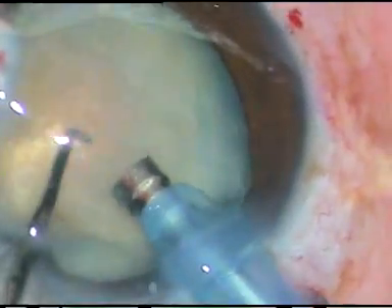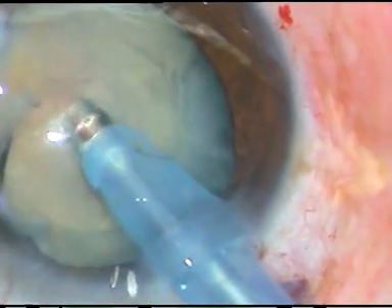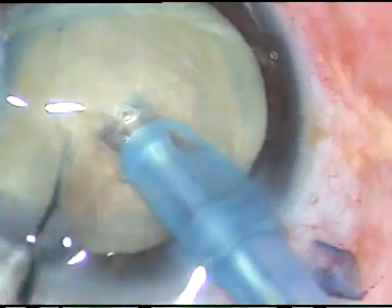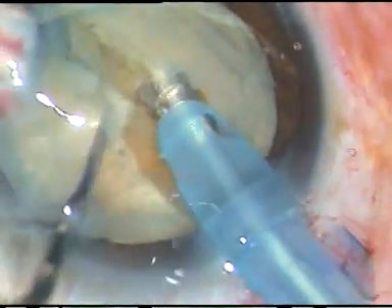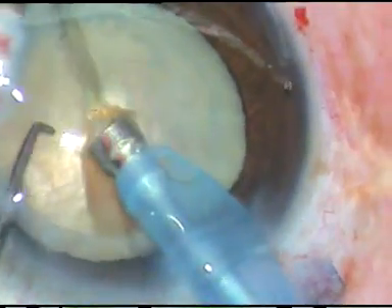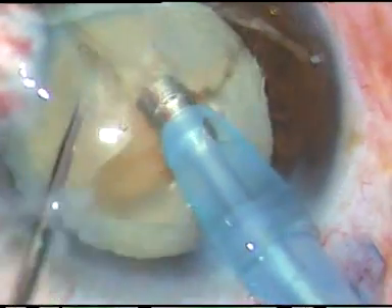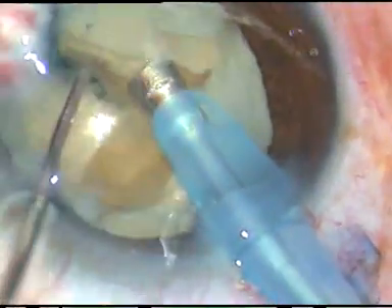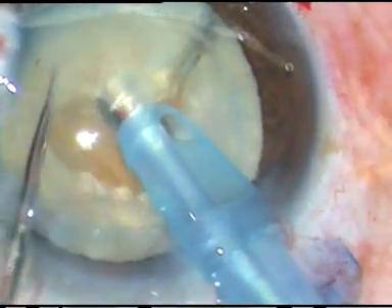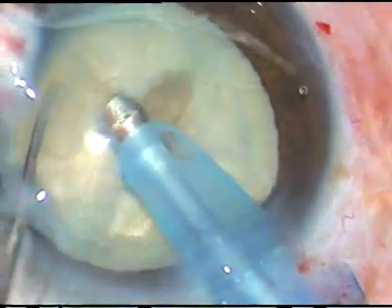So the PCP is a very good instrument. And for beginners, this is a boon. It is rounded all around. It has got a contour which conforms to the contour of the posterior capsule and can be very easily used through the side port.